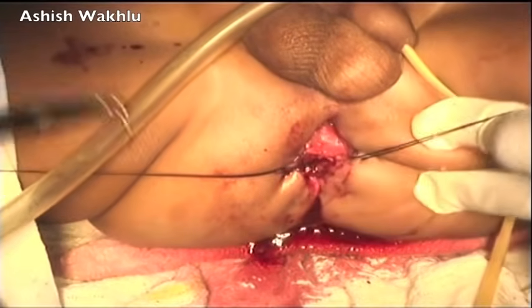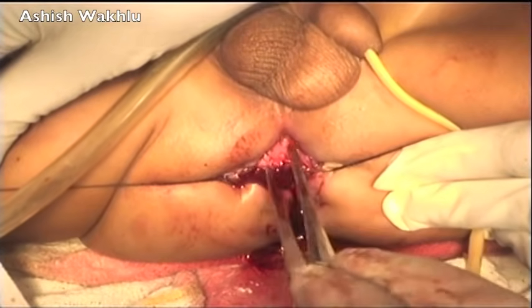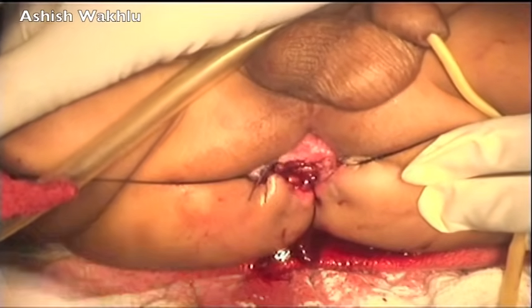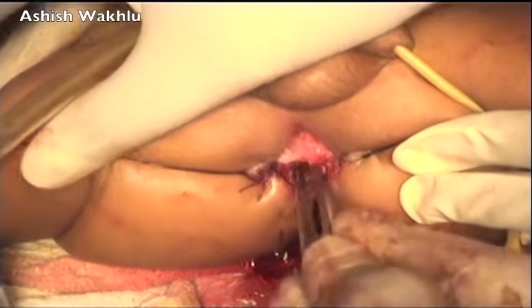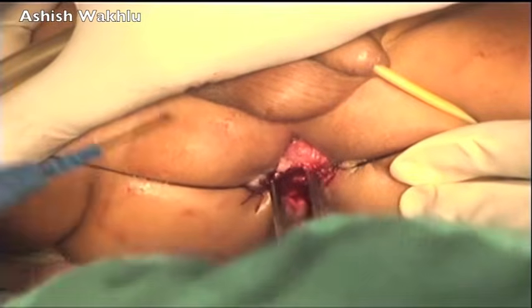Once two of the anoplasty stitches have been inserted, the artery forceps holding the bowel can be removed and the rest of the mucocutaneous sutures inserted to complete the anoplasty. There is no particular sequence in which these sutures are inserted. You can proceed clockwise or counterclockwise along the circumference as the need may be.